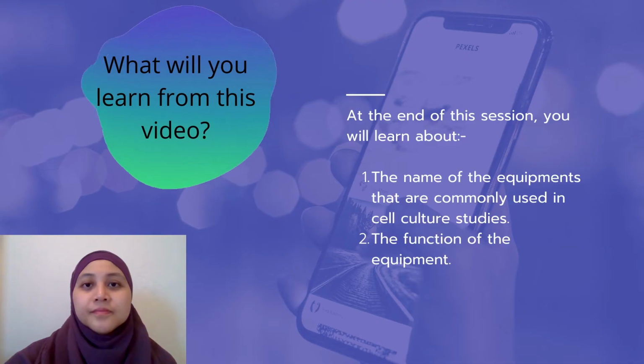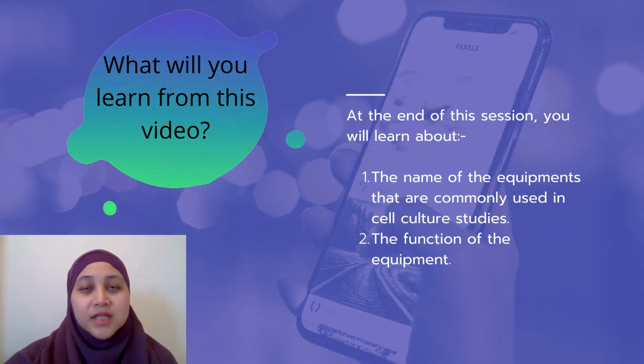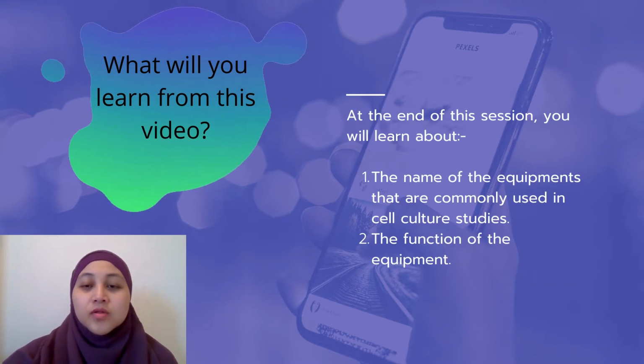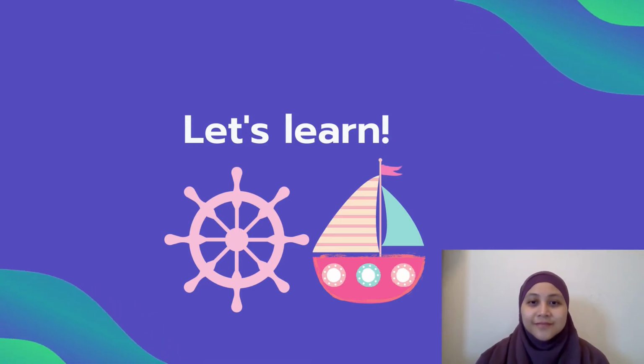good condition. Hello students, in this session, you will learn about the name of the equipment that are commonly used and available in cell culture lab and also the function of the equipments. Let's learn.